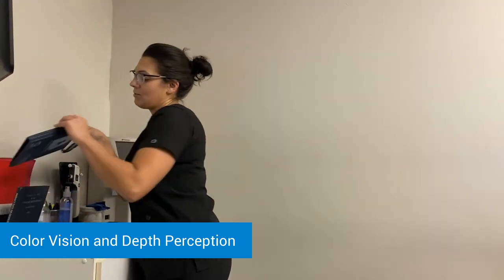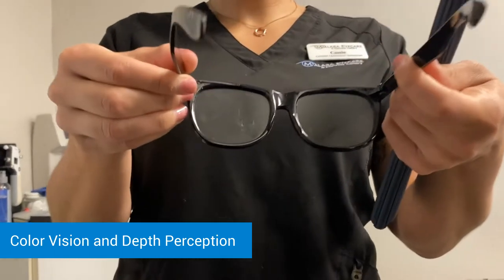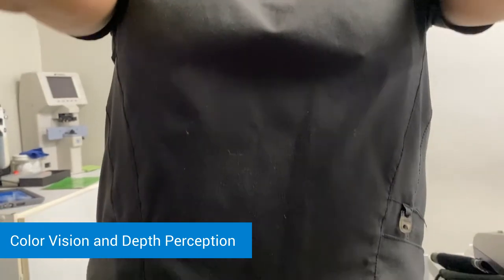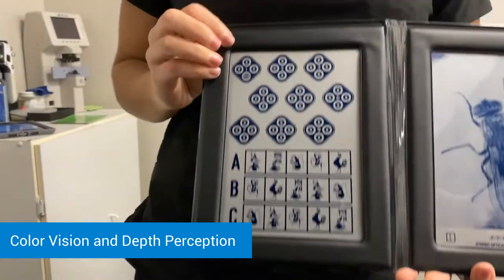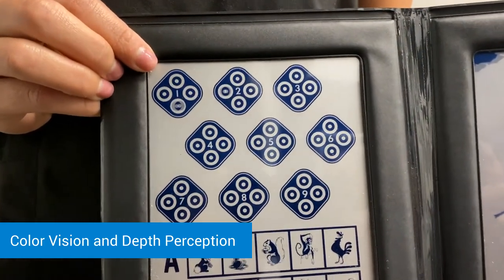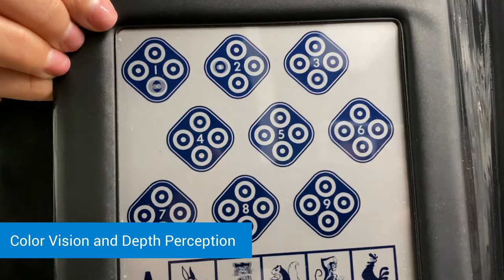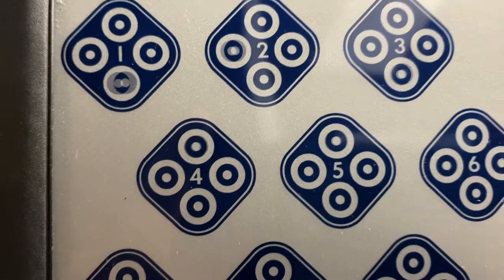Next we're going to check depth perception up close. I'm going to have you put these 3D glasses on for me. We're going to take a look in this booklet at the top left. In this first box you're going to see four circles — one of them should look raised up, that 3D effect. You're just going to tell me top, bottom, left, or right, and then we'll continue all the way down to number 9.